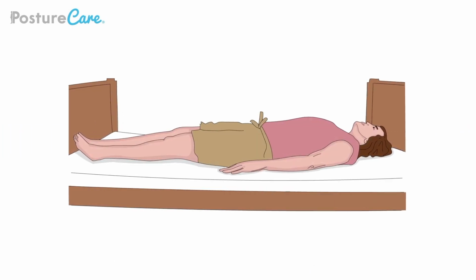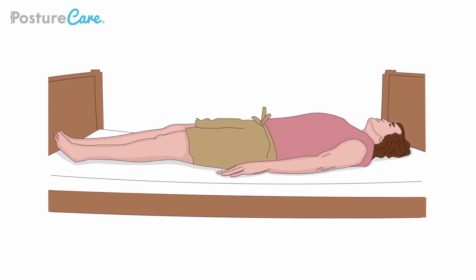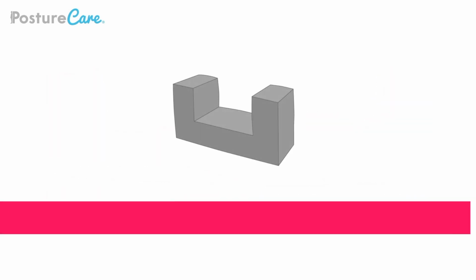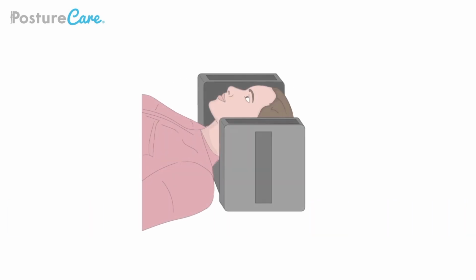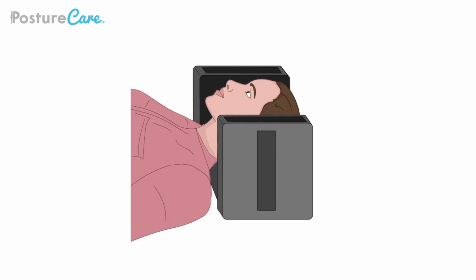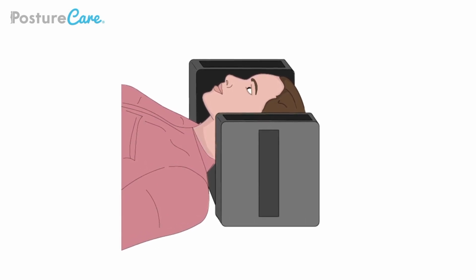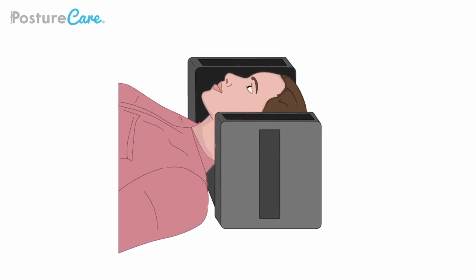Lying in supine. When transferring the patient onto the bed, please make sure they are central in the bed and as close to the headboard as is comfortable. Head support. Place the head support under as shown on screen. Please note that the patient may need assistance. By supporting the head and neck, your client's shoulders should be free to extend to the optimum position on the bed.